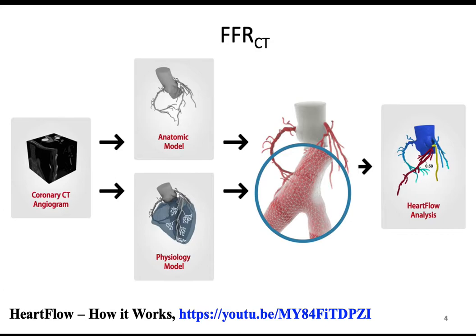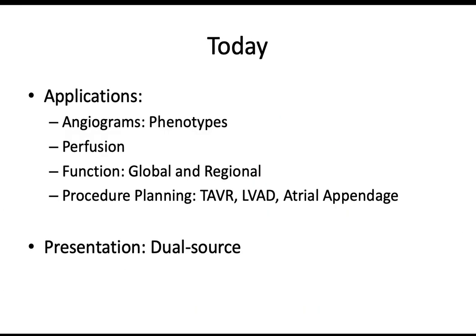So today we're going to cover a couple other applications. I think Elliot maybe had a slide on this in terms of angiographic phenotypes. So moving beyond just looking at whether the vessel is pinched off or not, but actually asking what is on the outside that is causing that impingement. Right? It can be a useful diagnostic measurement. We can also look at perfusion with CT.